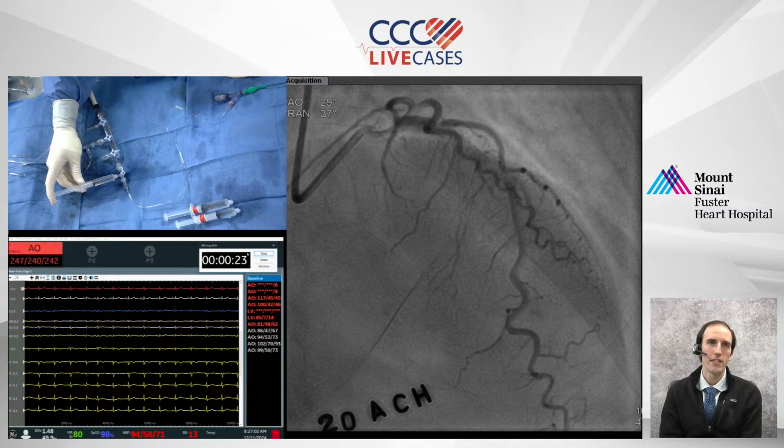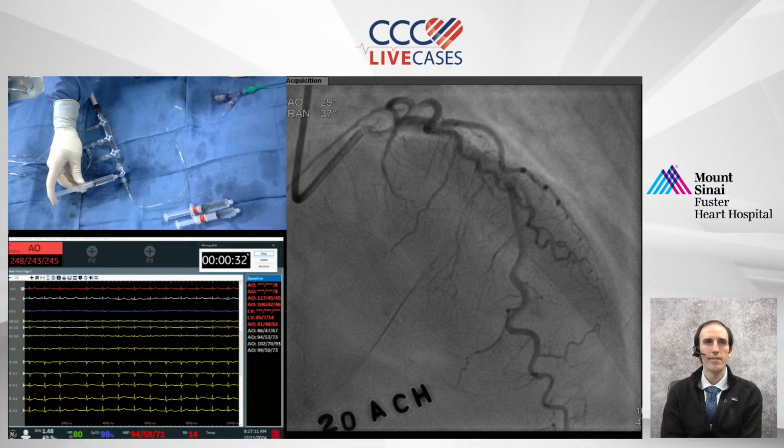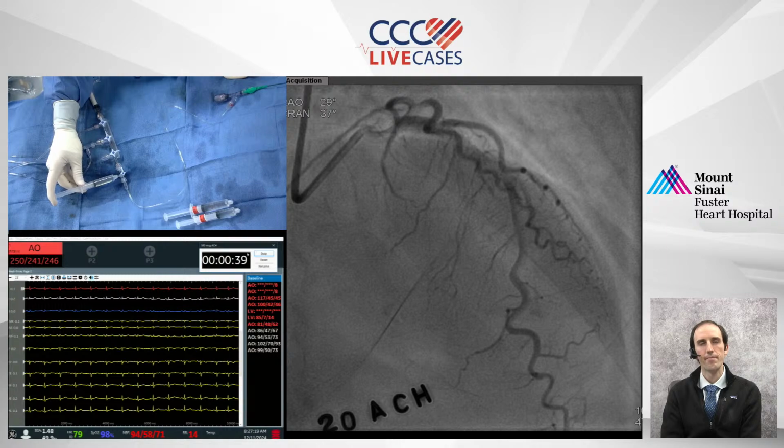So Dr. Moreno's question is a great one, and it's one that I wanted to ask you, Nat. The way we're diagnosing coronary epicardial vasospasm with acetylcholine is visual inspection. We were doing QCA in the beginning. All the literature suggests you need at least a 90% narrowing, as well as EKG changes and symptoms. I don't know about you, but in my practice, I rarely see all three. Yeah, I agree with you.